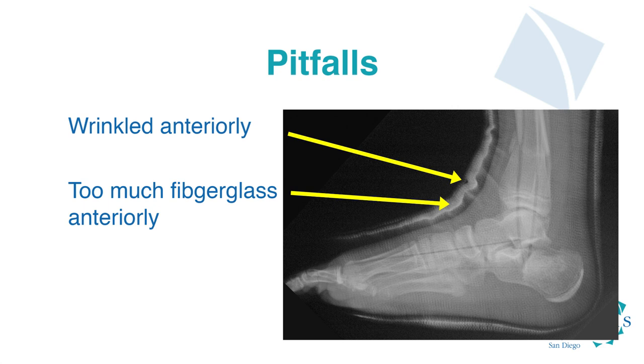The second pitfall is wrinkling anteriorly. This occurs when you begin molding the cast and then change the position of the foot. Once you start applying the fiberglass — and honestly once you start applying the webril — you cannot change the position of the foot relative to the tibia. This position must be maintained throughout the entirety of the cast application.